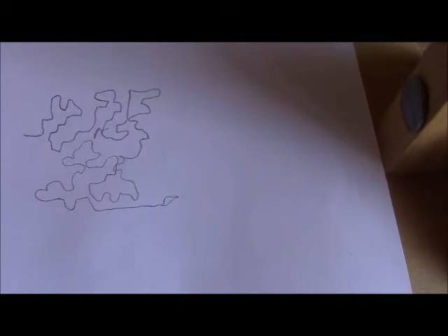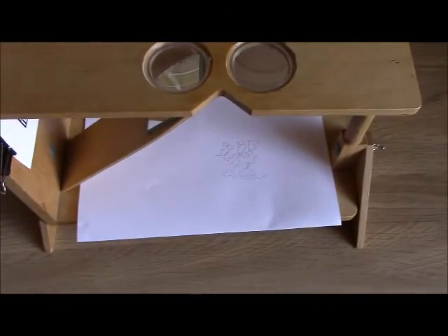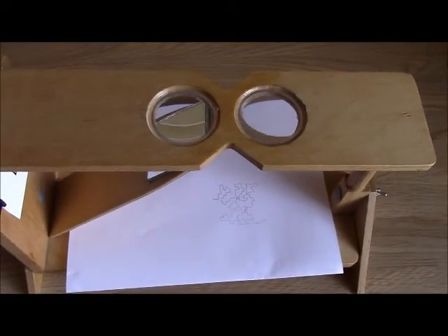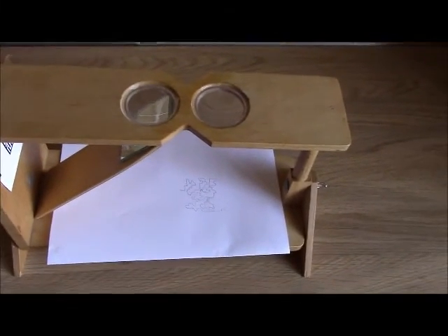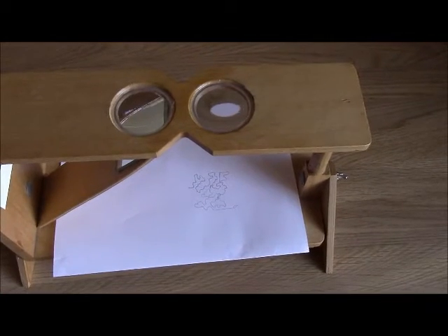Depending on whether your eye alignment is pretty stable or not, you will be getting better at this exercise. The Cheiroscope was invented by a guy named Maddox, more known for the Maddox rod.